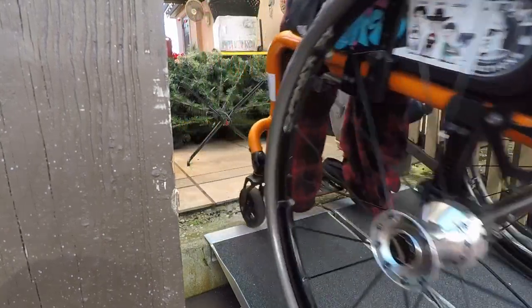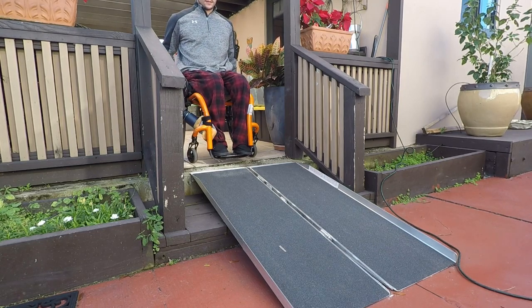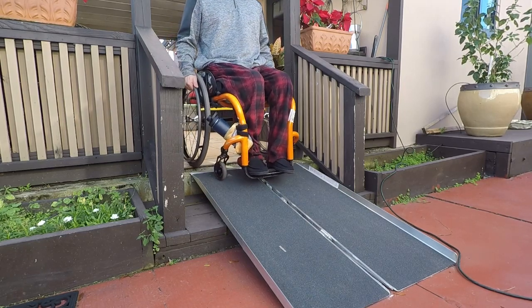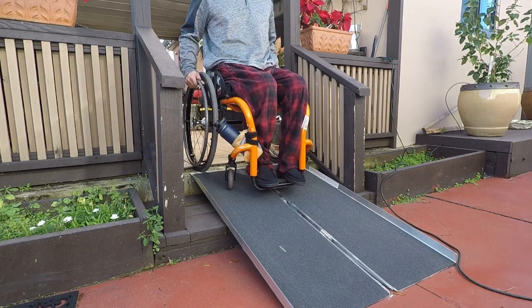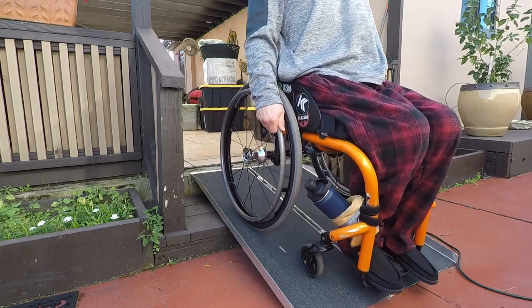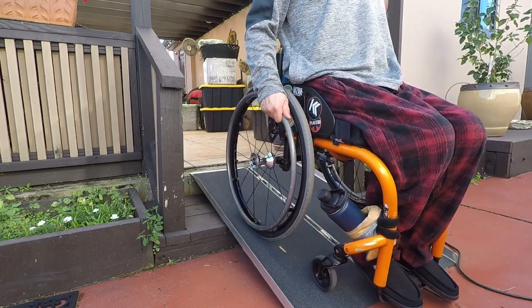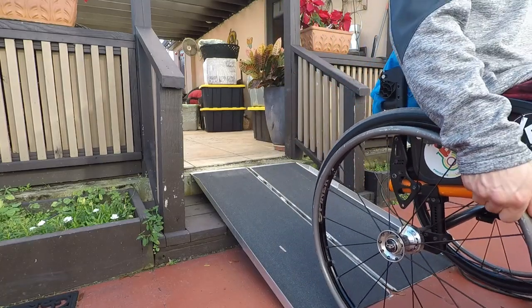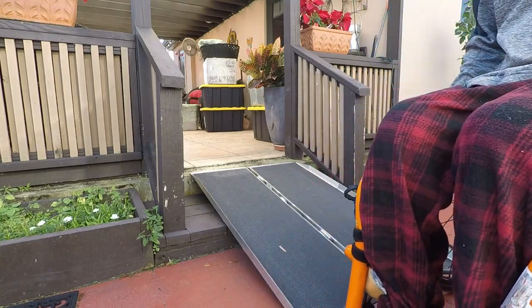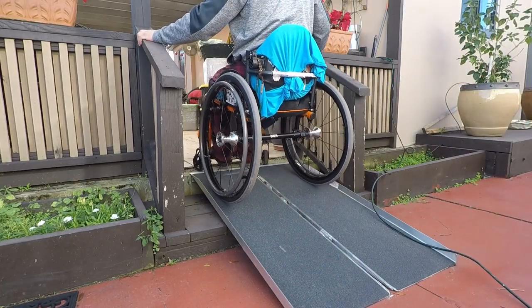Going down — I mentioned this earlier — without a wheelie I get kind of stuck and have to push through. Watch the end: I can't even roll because the foot plate hits the ground on the downslope. So whenever you're going down a slope, it's always better to go backwards — always better to go like this.